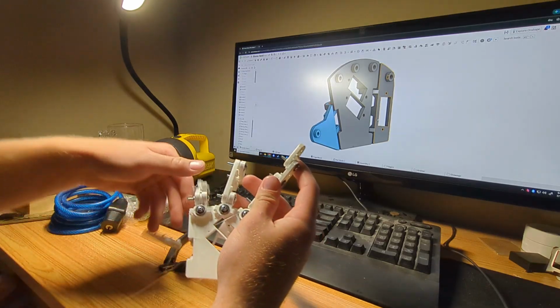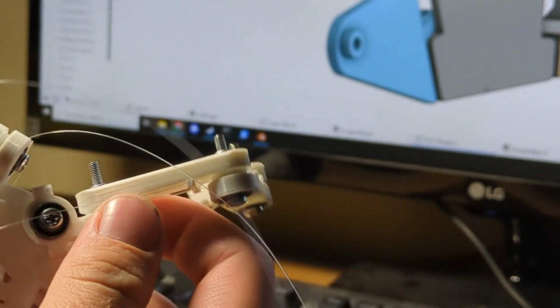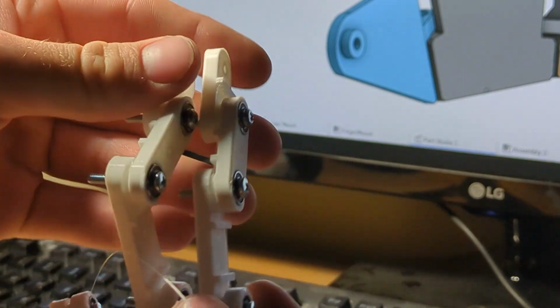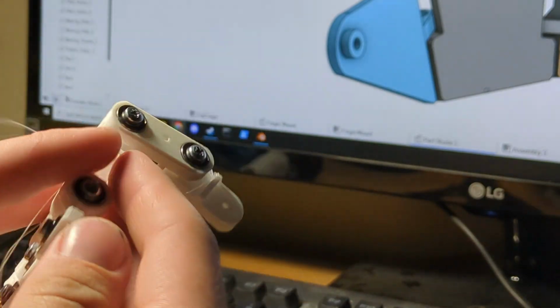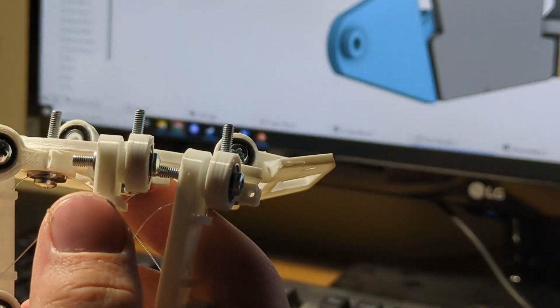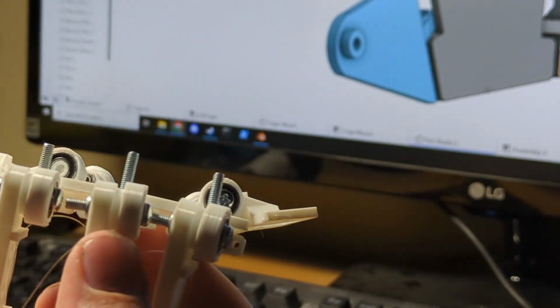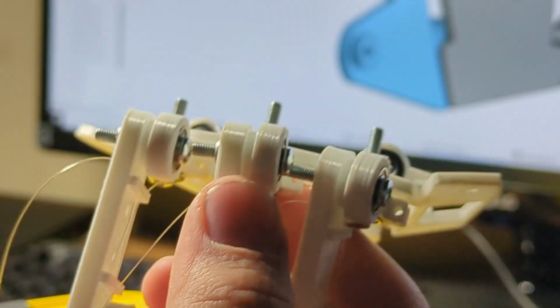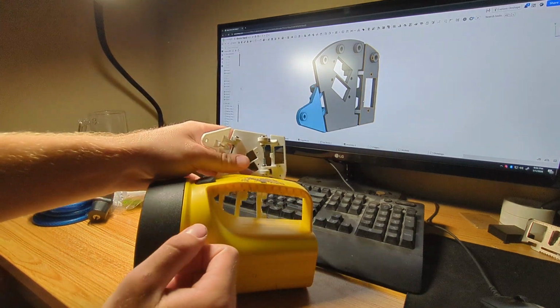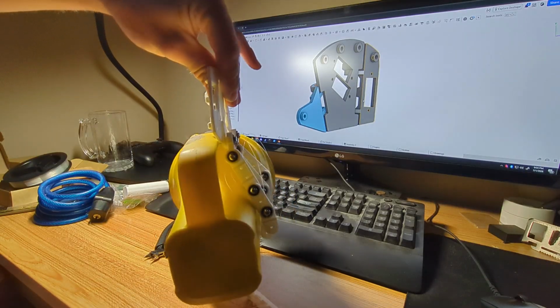For now, until it becomes a problem, I'm going to continue using these screws here. They are very long, but they're just what I have on hand. They don't really cause a problem here, and won't unless I really get fine control and they start running into each other. Only other annoying thing is that there's a bunch of screws sticking out the palm quite a lot, which is kind of okay. Like the pads of your hands stick up, right? But trying to grab this flashlight, I fooled myself thinking that it was grabbing it successfully when it was really just these screws hooking it and picking it up. So you can see there the fingers are doing literally nothing.